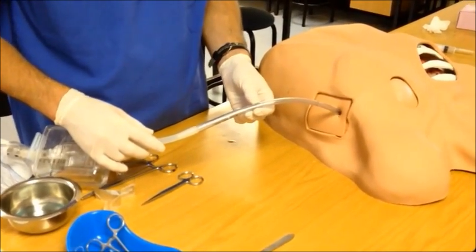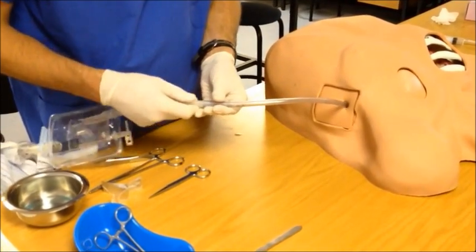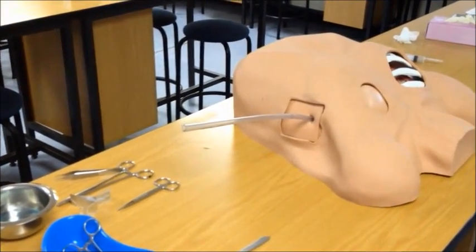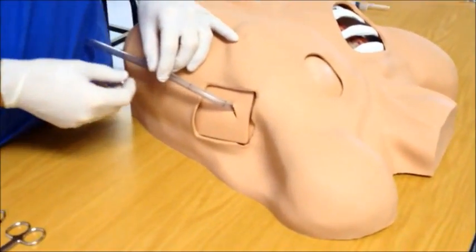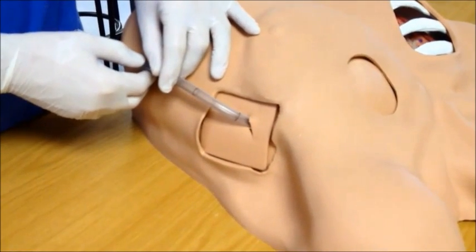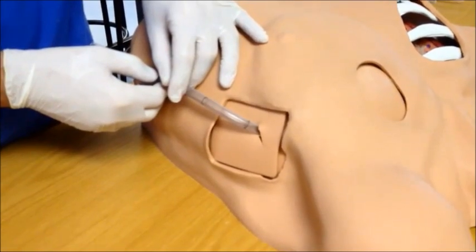Once the position of the tube has been confirmed, it is time to secure the tube to the chest. There are many different techniques that aim to secure a chest drain to the chest wall. I am going to show you one safe technique using a vertical mattress pulley suture. Whatever technique you use, please keep in mind that your suture should safely anchor the tube to the chest wall without resulting in undue tissue tension or ischemia.